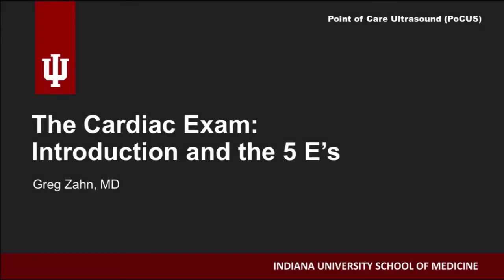My name is Greg Zahn. I'm an assistant professor of clinical emergency medicine. We're going to cover an intro to cardiac echo.